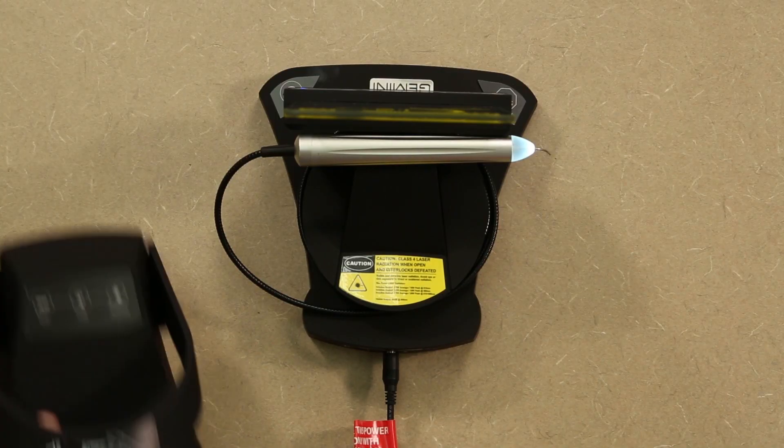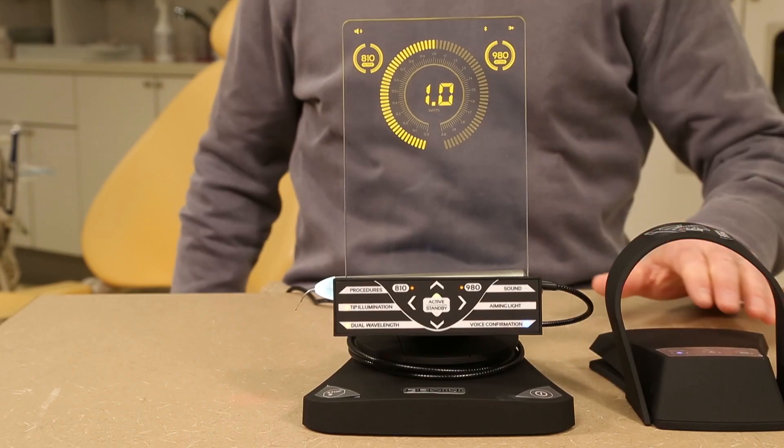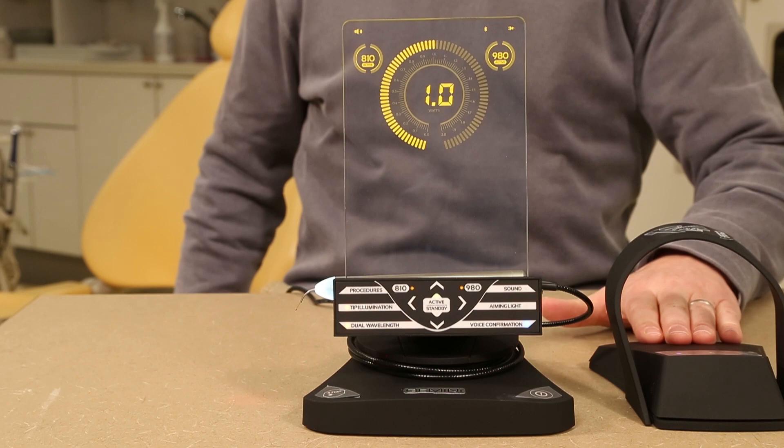Note that with the Gemini in active mode, it will fire on a depressed foot pedal. Without touching the foot pedal, the tip and laser are not firing.